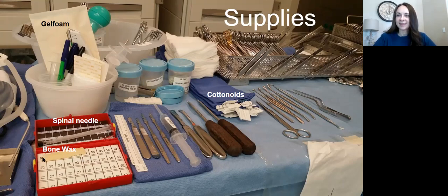And then bone wax. I've already talked a lot about this. Bone wax on these cases, I would not leave it in a square like this. I would separate it and have it in little balls ready to go, so I can put it on the back of a Mayfield and hand it over. I would even have surgeons that would just put their hand out like this sometimes and I'd put the bone wax ball in their finger so they could insert it. So lots of different ways on that.